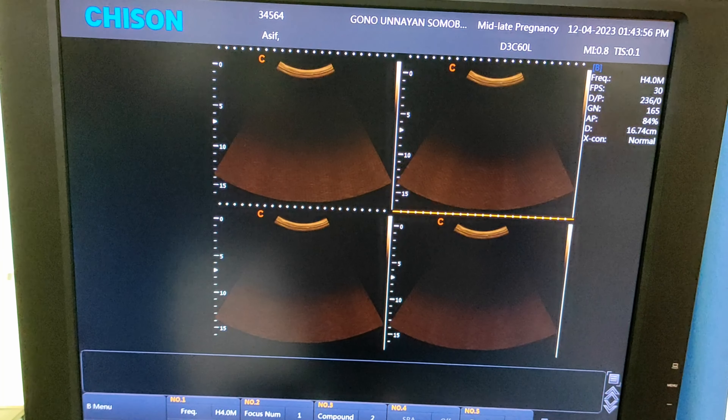This one is the arrow button. The arrow button is used to indicate any type of organ on the screen. Now press the clear button to remove the arrow mark from your screen — see, the arrow mark is removed.